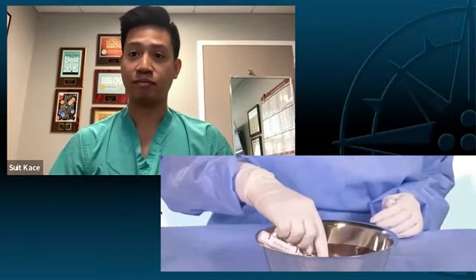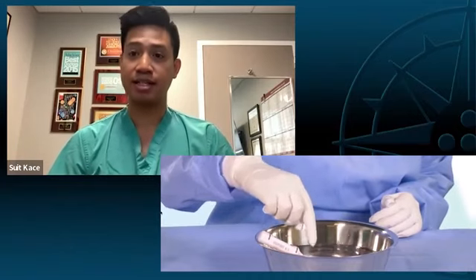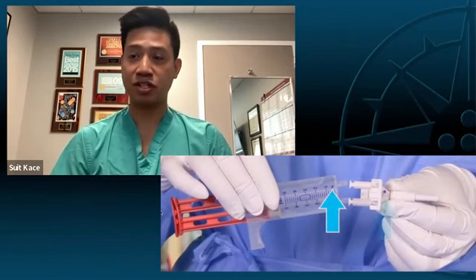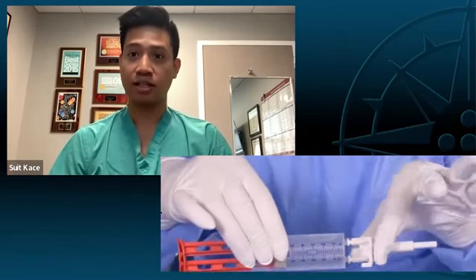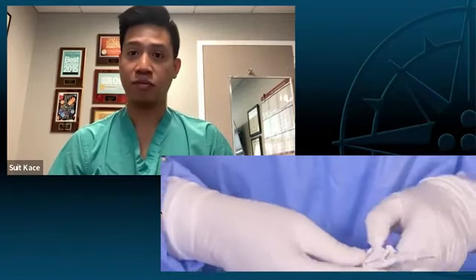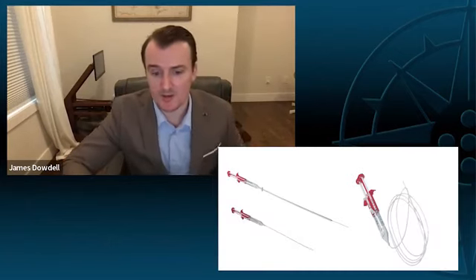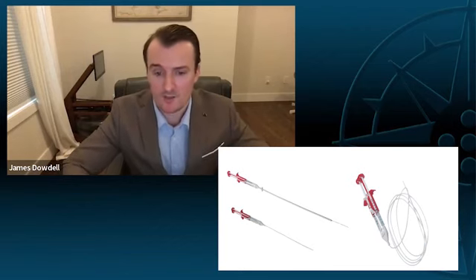So what you want to do is, once it's all thawed out, you want to snap and lock together the syringe, and there's a tip, and it'll go on together. And once you connect that, it's pretty much ready to go. There are various tips available, Michael. The MIS and endoscopy, obviously don't use endoscopy. MIS surgery, we could potentially reach harder to get places with the MIS tip. I typically don't use it.